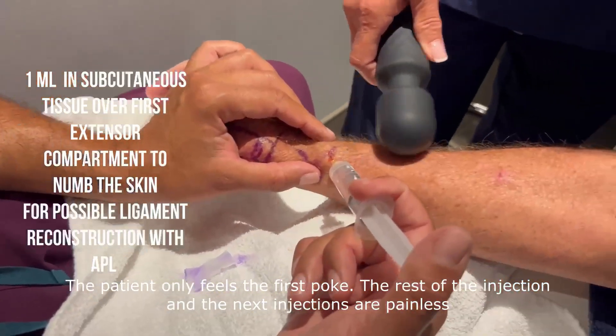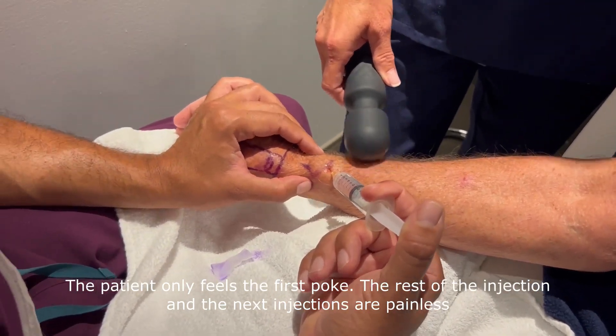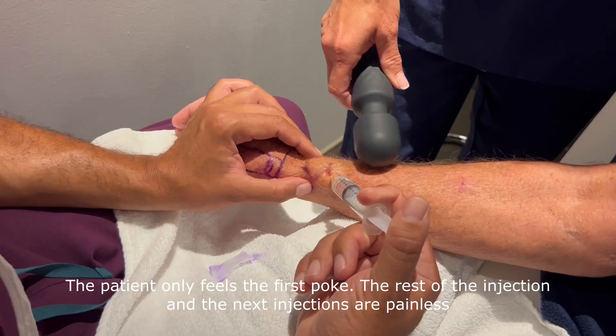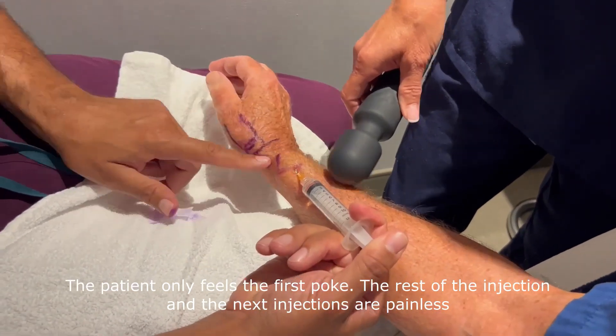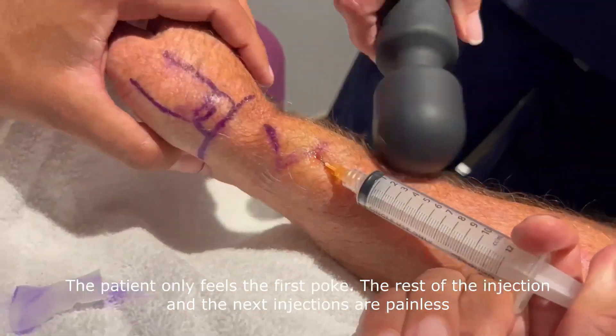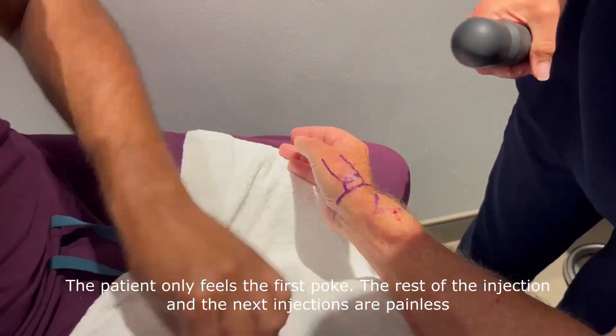We're doing the same thing over the first compartment of the wrist extensors, in case we need to perform a suspensionplasty in association with a trapezectomy if the implant reconstruction is not feasible.